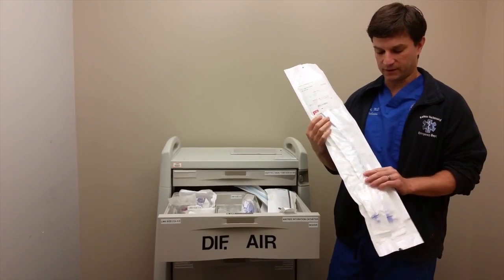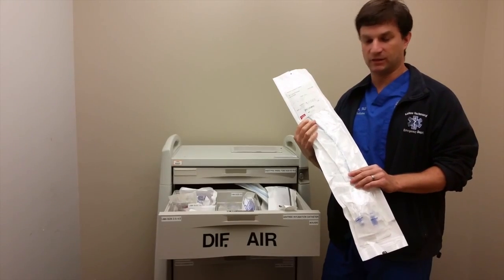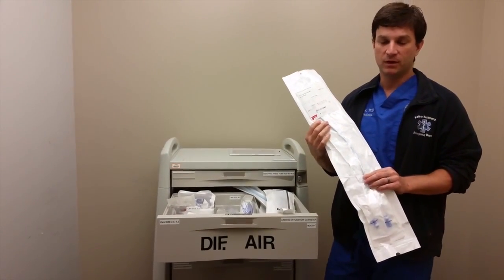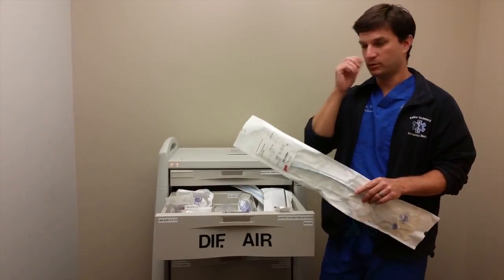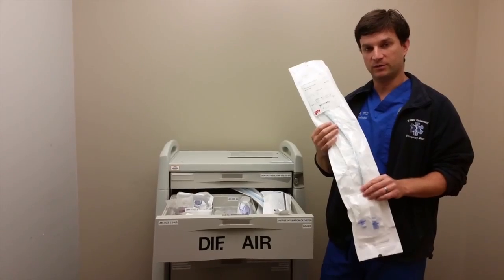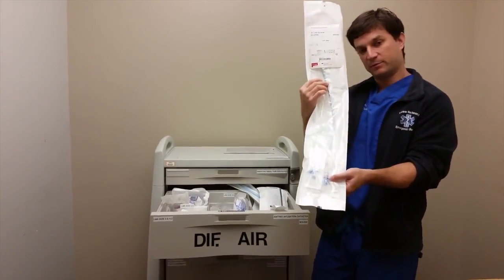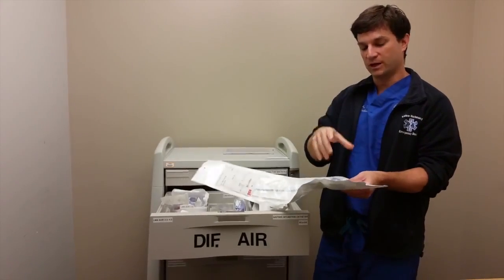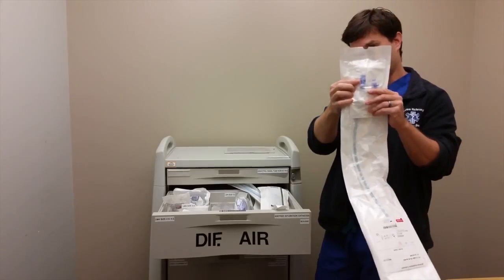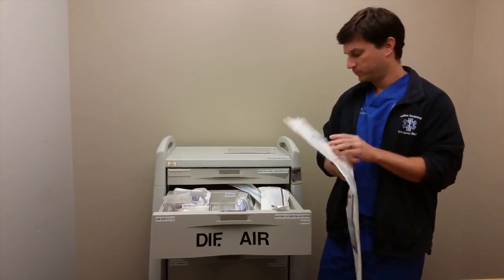And if you do find that, for example, you can't get the tube in or whatnot, you can't advance the endotracheal tube because of size disproportions, or the nose isn't working out, or whatever, you could always advance the bronchoscope into the lungs and slide this catheter off, and ventilate through this little adapter here with oxygen. You can use an Ambu bag. Actually, it hooks up just like you would for an endotracheal tube. At the end there's an adapter, and you squeeze oxygen in while you're trying to figure out a backup plan.